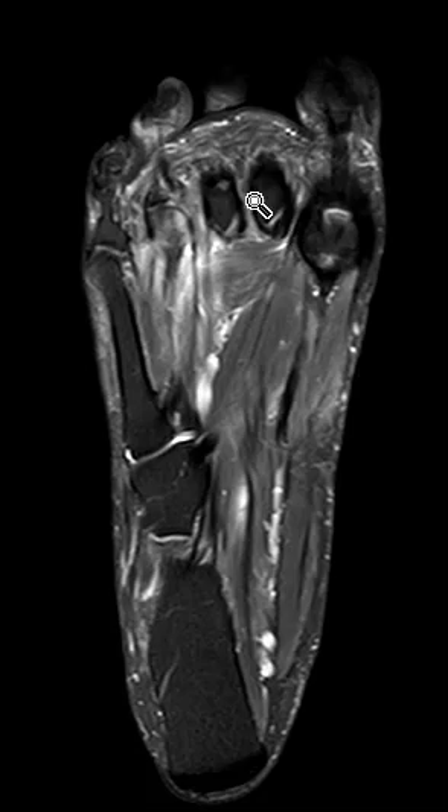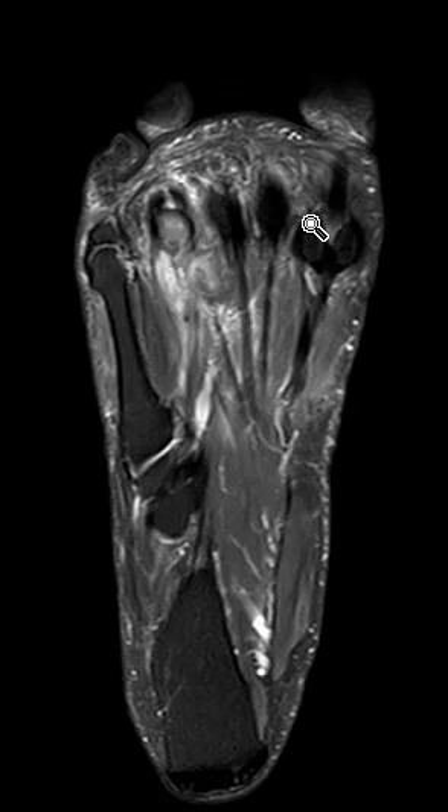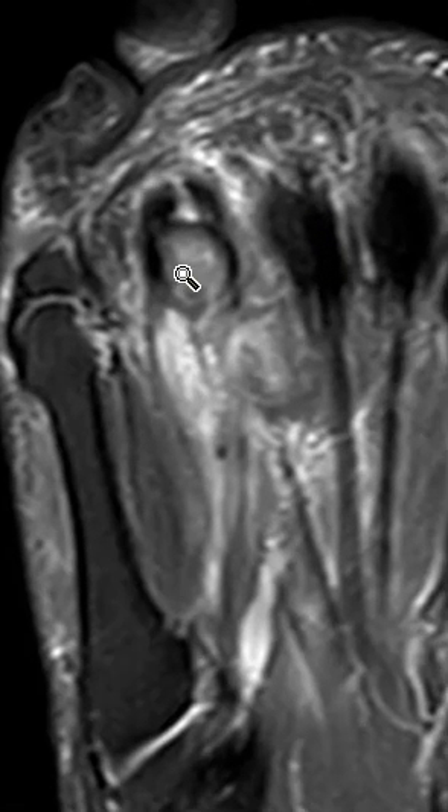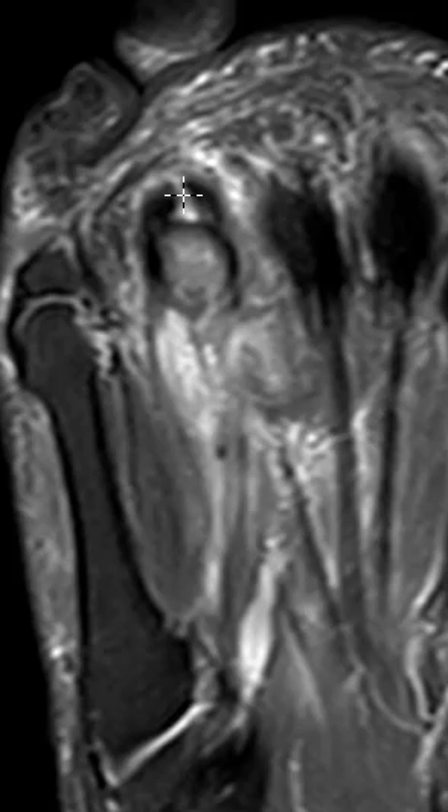This is where I usually look at the plantar plate on the axial image. Normally it's the second plantar plate that's injured. Going along the plantar surface right here, you usually see a nice dark band. I see this nice dark band — that one looks normal. Going to the third, I don't see as well of a dark band but it looks halfway decent. Now at the fourth, we see this longitudinal band of brightness — and that longitudinal band of brightness is a plantar plate tear of the fourth metatarsal.